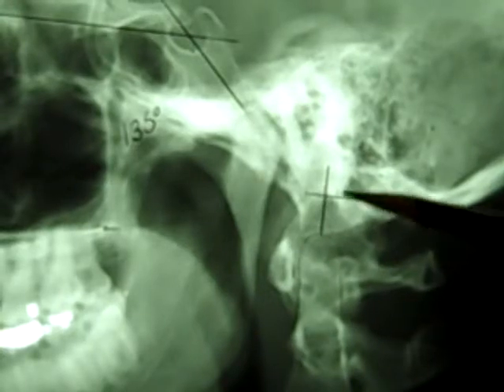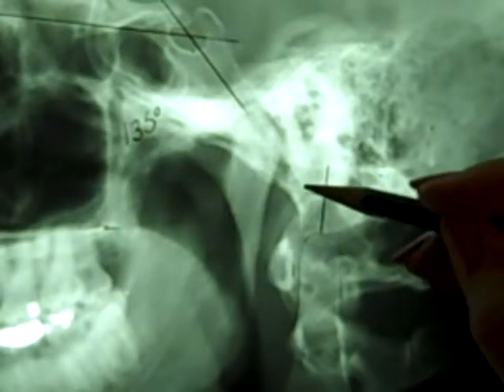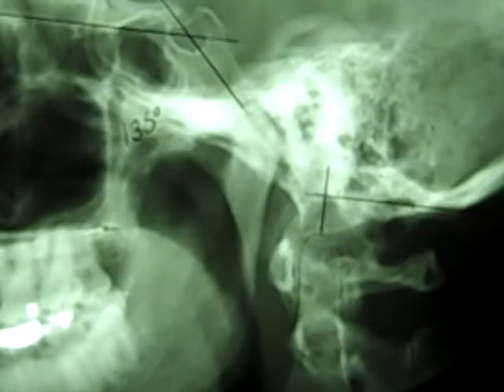The second part is that we're looking at this line, and does it fall in the anterior 1/4 of the foramen magnum? So if I'm looking at the distance from here to here, is that in the anterior 1/4? And it is. If it is not located in the anterior 1/4, we need to be worried about a fracture and or dislocation of the odontoid process.